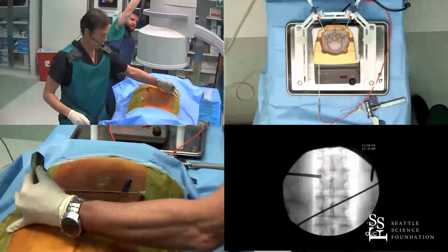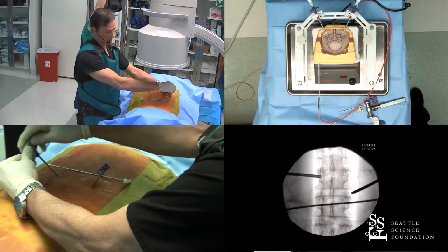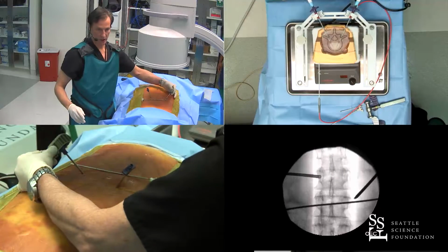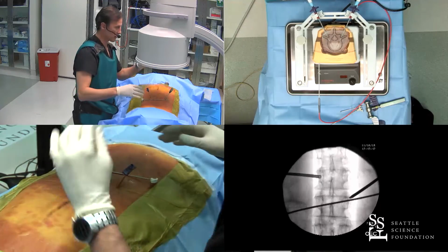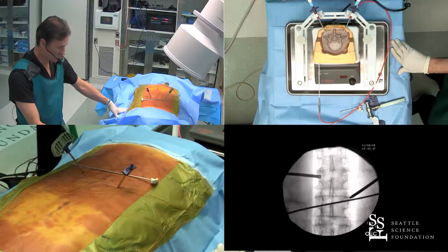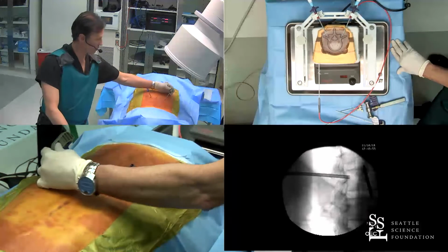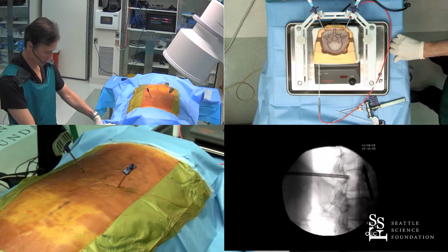So we're going to come down, and you can either do this in the en face view, or you can do it in the AP view, and we're going to feel osseous. And then we're going to go ipsilateral about 30 degrees. We're going to make sure we're in the right approach. And if you want to do this all en face or in the 20 to 30 degree ipsilateral oblique, that's perfectly fine. So what we see here, if we could drop it, move towards you just a little bit.